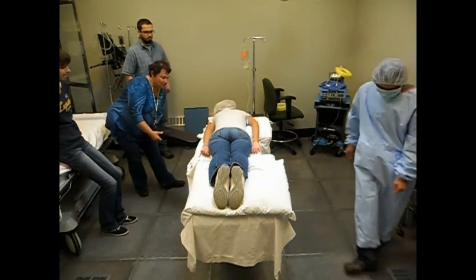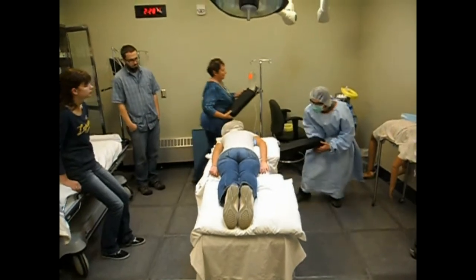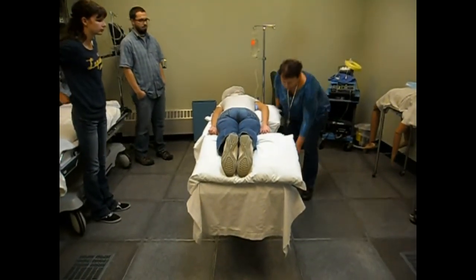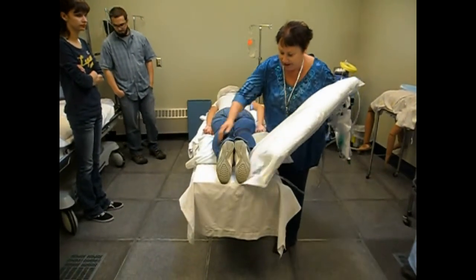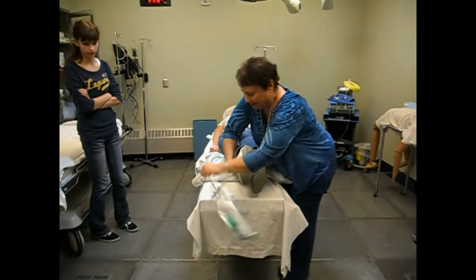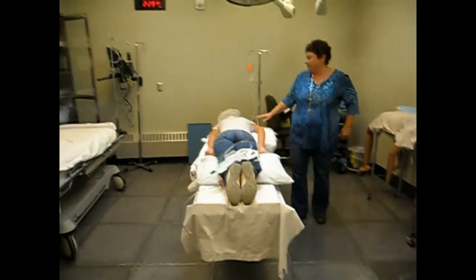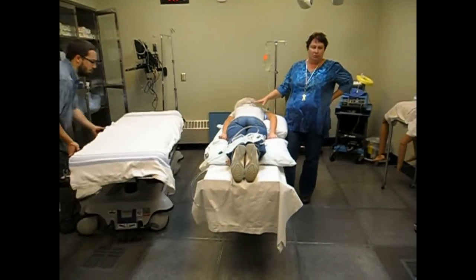Now we have to take these both off because you can't get the bed in without doing that. Okay, now where is our Foley? So we want to take our Foley that was up at the head of the bed, and we want to bring that back. And we could take this out for now. And we want to make sure that this gets taken with us. So for now, what I'm going to do is put it here. And now let's butt up the stretcher. Always make sure somebody's staying with her. So whoever goes out in the hall to get the bed, somebody should be with her.